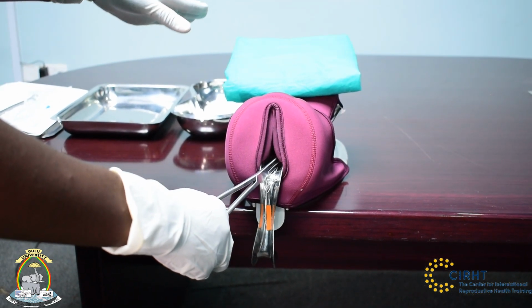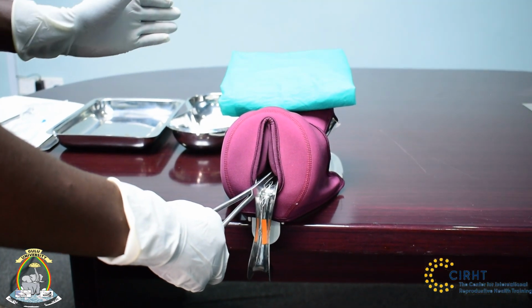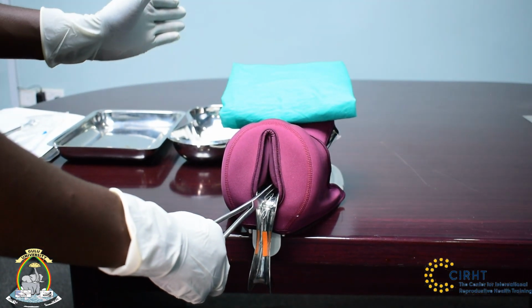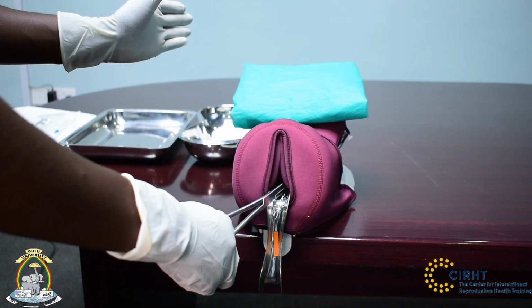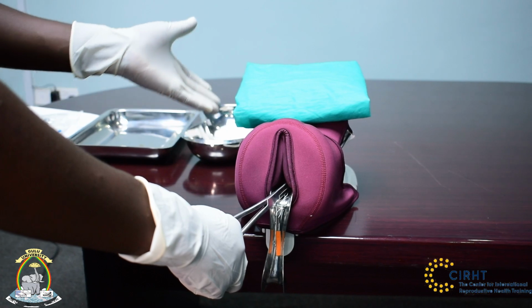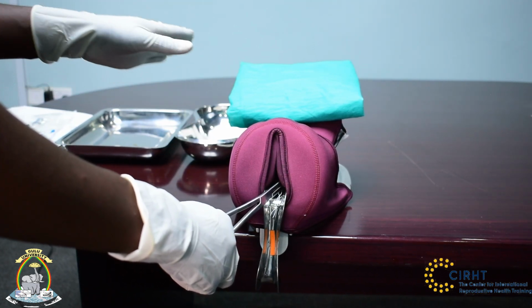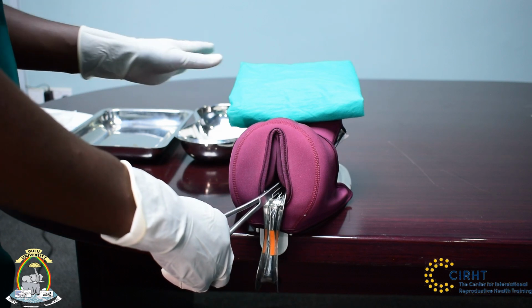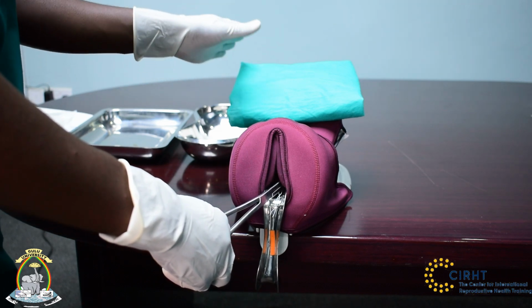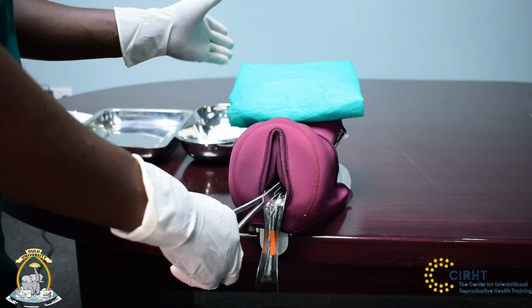So here we need to elevate the uterus because there is a vaginal uterine angle which is quite sharp, so it doesn't allow you to further smoothly progress. That's why you're feeling resistance here. So we need to reduce that angle. So by elevating the uterus, we will flatten that angle so we can progress.